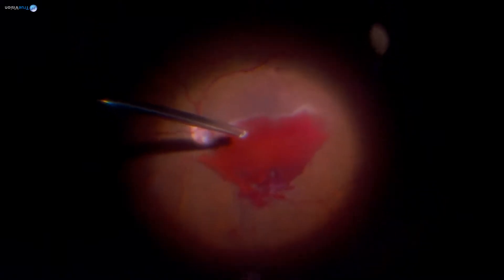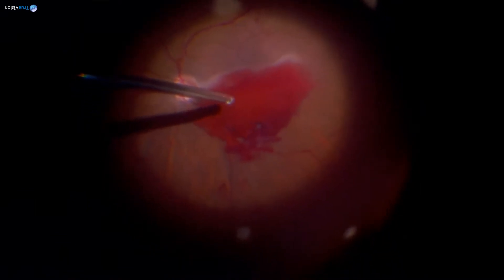Now I'm approaching the hemorrhage carefully. This is a subhyaloid hemorrhage — it's typically a boat-shaped hemorrhage. The patient is lying down, but if sitting up you'd see the boat shape much more clearly. It's lined by de-hemoglobinized blood around the sides. I'll go into vacuum mode to check if the hyaloid is still attached. The hyaloid is still attached and is holding the blood.